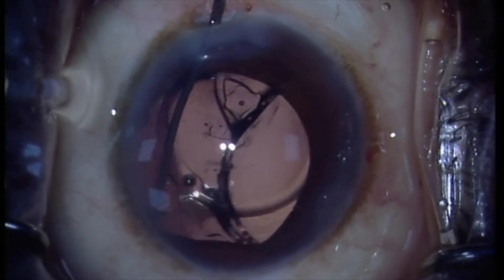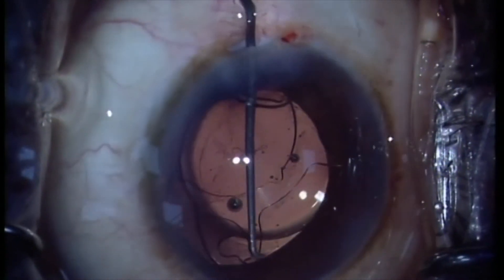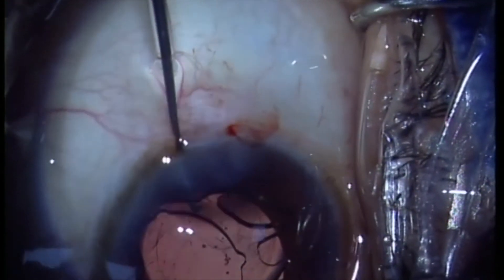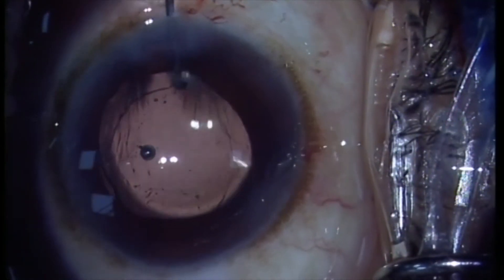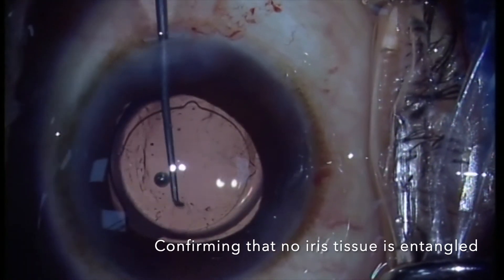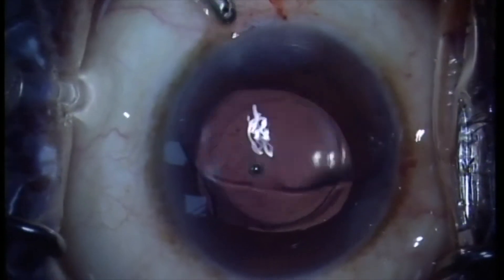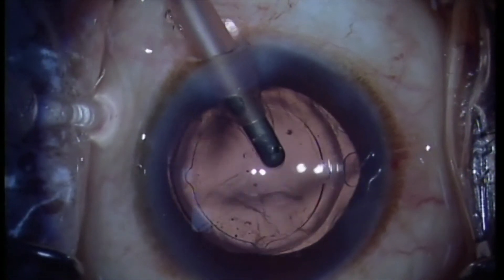The other half of the ring continues to unfold, and similar maneuvers to direct the haptics into the sulcus are applied on the other side as well. Once all four haptics are apparently in the sulcus, it is important to ensure that the iris is free from any entanglement with the device. The Sinskey hook is used to nudge each haptic at the broad haptic-ring junction and pull it back towards the center slightly; the haptics immediately recoil back, releasing any entangled iris tissue. Intracameral pilocarpine may optionally be injected to ensure a free iris and a circular pupil.